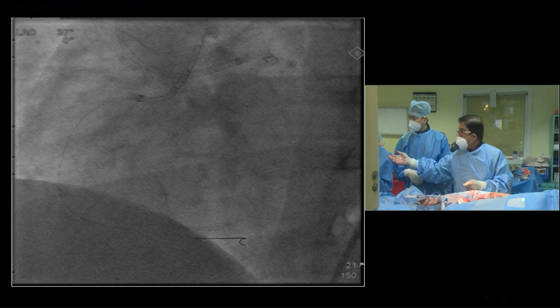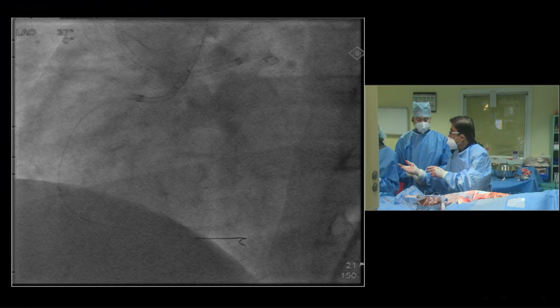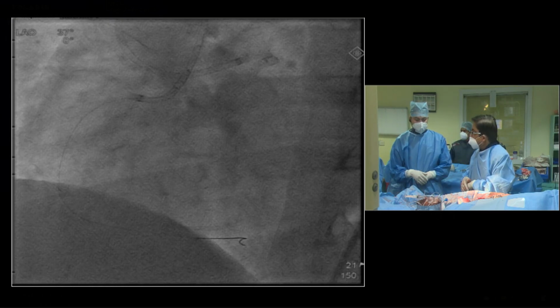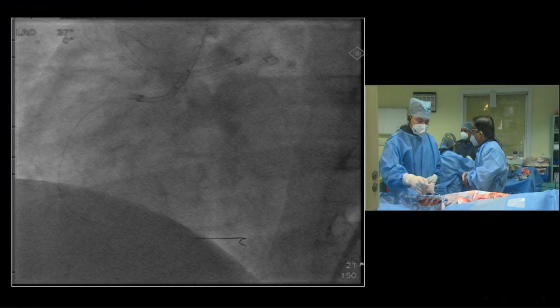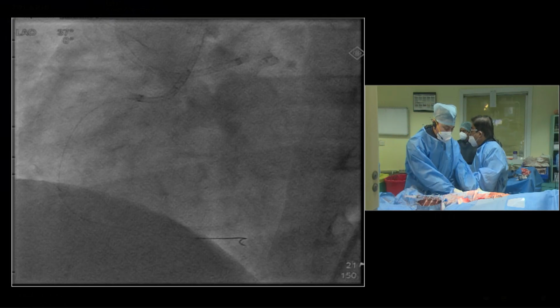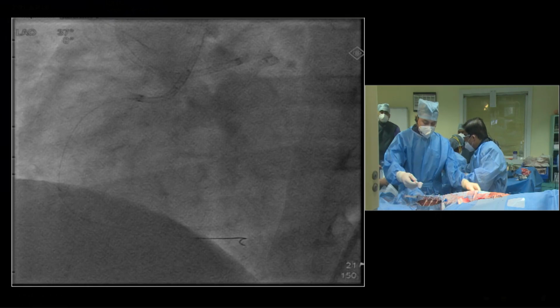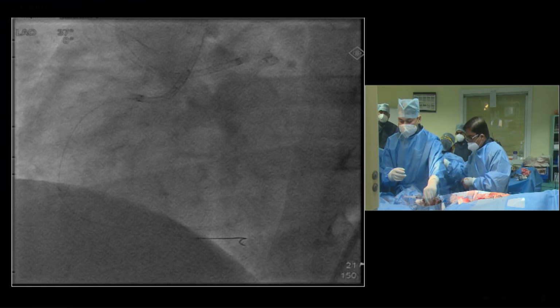The retrograde channel that I needed was longer, almost like an epicardial channel, from the apex. If you wanted to take that, you have to cut short the catheter. That's the only way. So you have to cut short the EBU catheter, use a 90 centimeter, 1.2 or 1.5, otherwise take a short catheter.